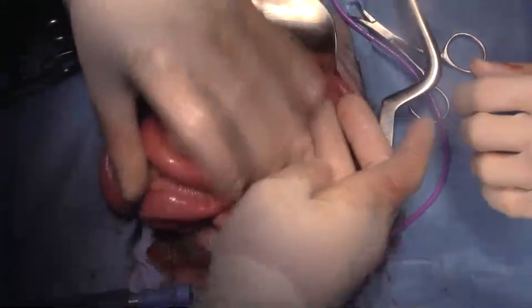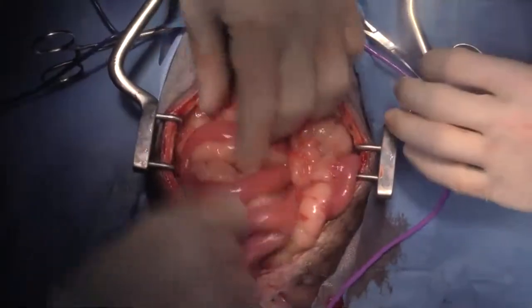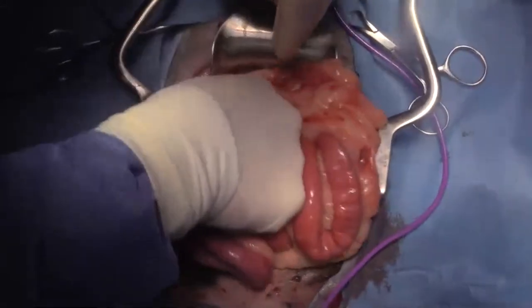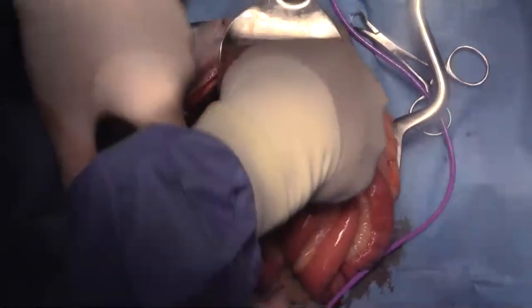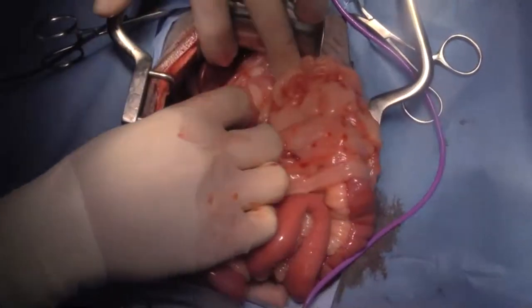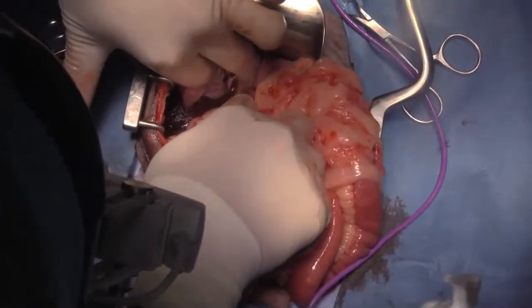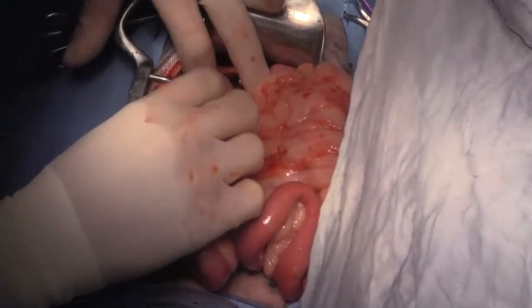So what we're going to do is make sure that the bile duct is patent in this case. So I'm going to find the duodenum again. Can we get some moistened swabs, Jeff? It's oftentimes pretty hard to make out the common bile duct in these guys when they're so overweight. It's going to be running right in this section here and coming up into the duodenum, right in that area. So I'm just going to get a 25 gauge needle, please.